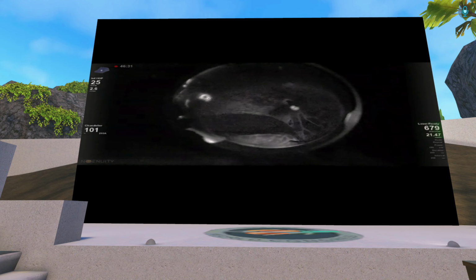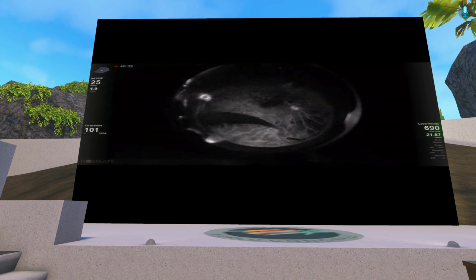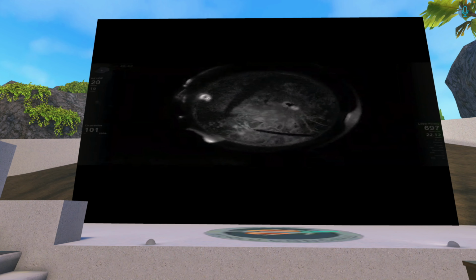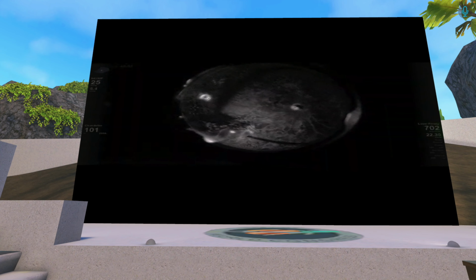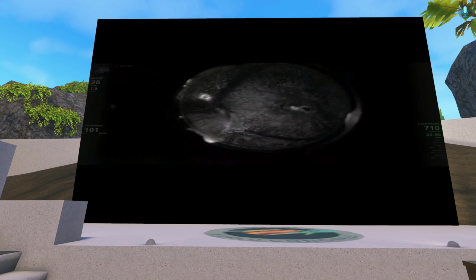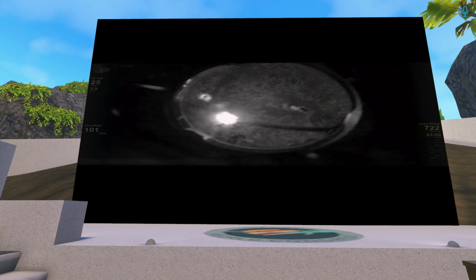Otherwise, in other settings, we just laser the periphery and we kill a healthy retina. And since we are surgeons, I think that we need to be more precise, and I like that I have the ability intraoperatively to be guided, like the neurosurgeons have been doing for the last 10 years, because they also have these imaging modalities. And I think this is a huge step forward in how we might treat the vascular pathology of the eye.